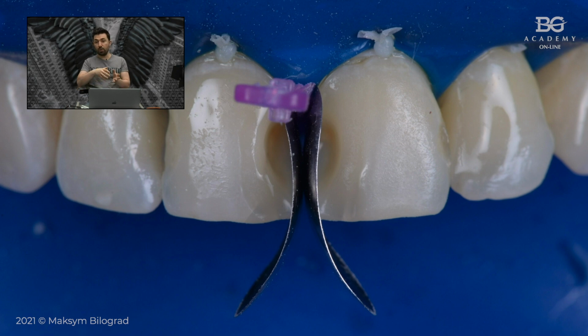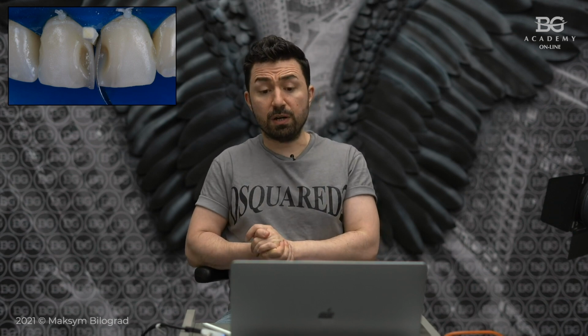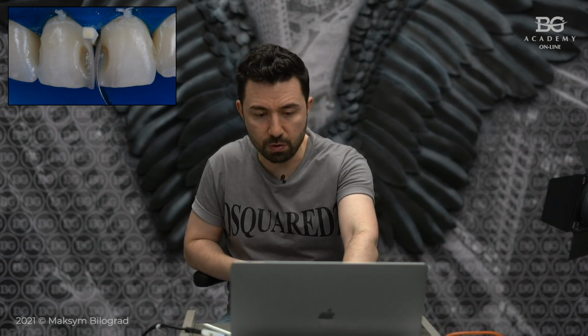And while we are restoring one interproximal contact, the matrix on the adjacent tooth reserves space for the proximal contact for that adjacent tooth. So that is the trick. And here you can see the way. So we have restored the interproximal area on tooth number 11 with enamel shade. Then we removed the matrix from that tooth. We used another wedge, which is a little bit tighter, to create a tight interproximal contact. And now we are ready to restore another interproximal contact. So here it is. We end up with proximal contacts.